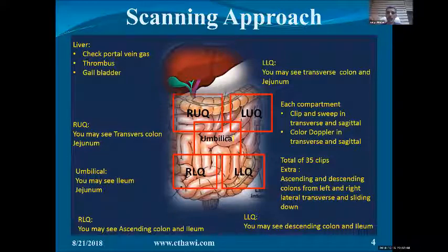You have to see the bowel moving. If you don't see bowel moving, then mostly you have air. So either you compress if the baby is not sick, or you move your probe, the transducer, laterally, or you turn the baby. For example, if you are looking at the left lower quadrant, turn the right side up, so the air goes to the right, and then you can see the left. Okay? Do we agree on this? Got it, yeah.